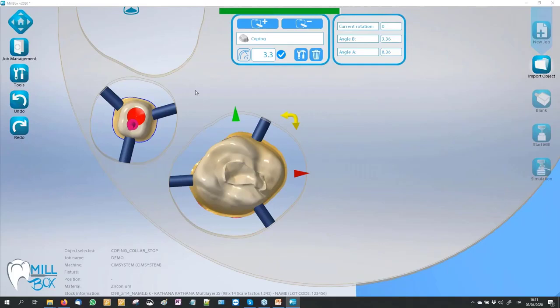We continue our compilation of the project, bringing and moving other STL files — for example, a different angle and abutment — and meanwhile the calculation goes on for our full anatomic crown. We can continue with our job in our lab or in our meeting.